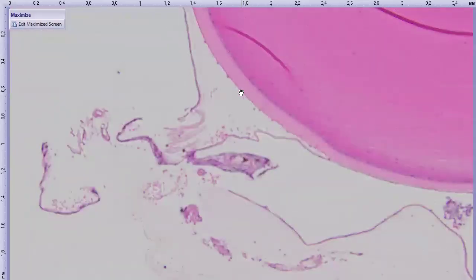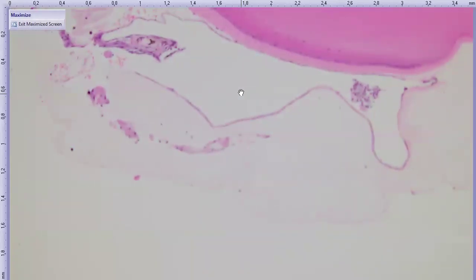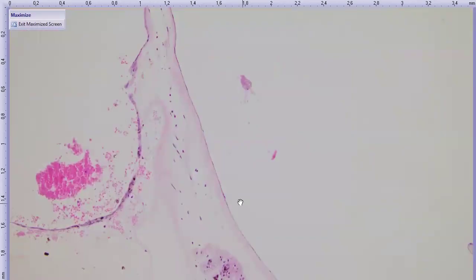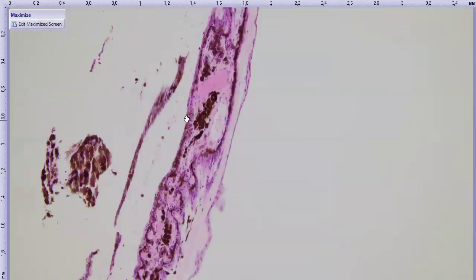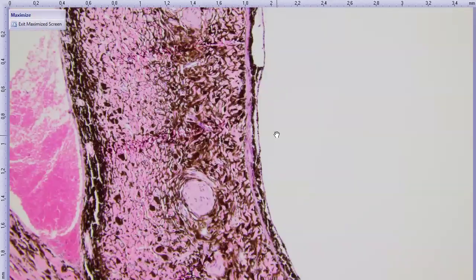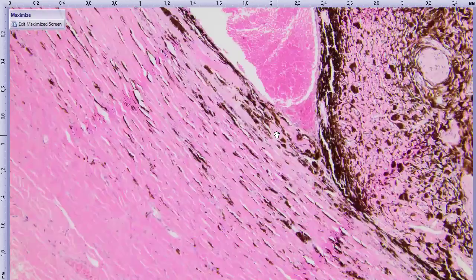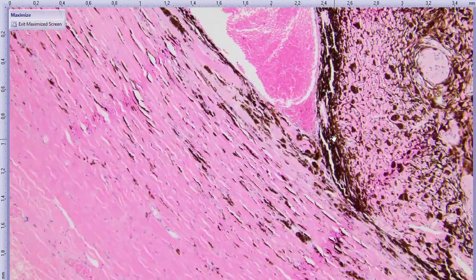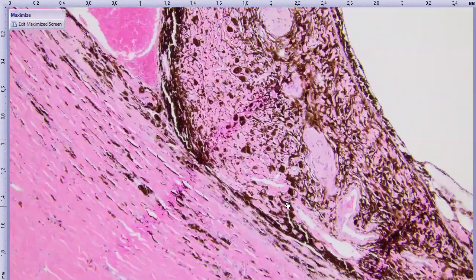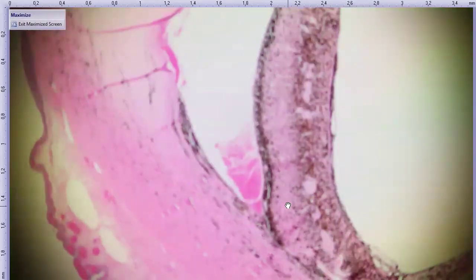Again, we can see similar cysts on the lens capsule and multifocally on the ciliary body, with some of that basement membrane production. The iris does have some attenuated cells on the anterior and posterior aspects of it. Some of these might be collapsed iridociliary cysts. Here's a look at the fibrovascular membrane crossing the angle, causing peripheral anterior synechia. We've got some pigmented cells dispersed in our trabecular meshwork, so we've got a little bit of pigmentary dispersion as well.